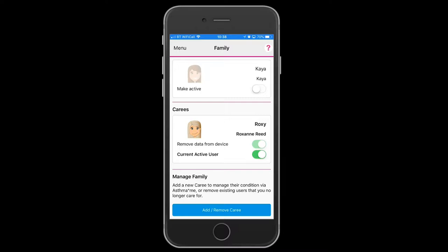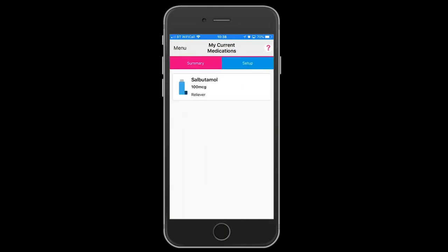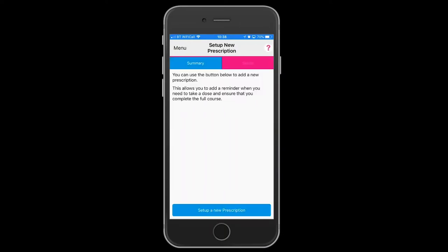Touch the medication tab. We have a salbutamol which is a reliever. We're going to set up a new prescription.